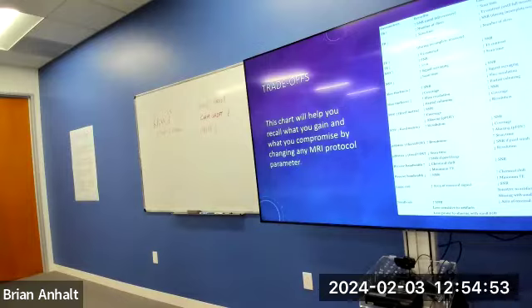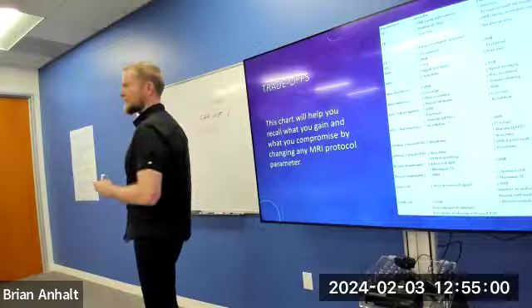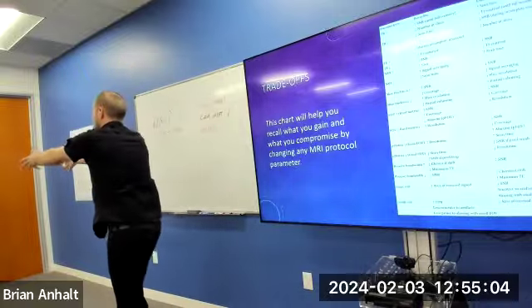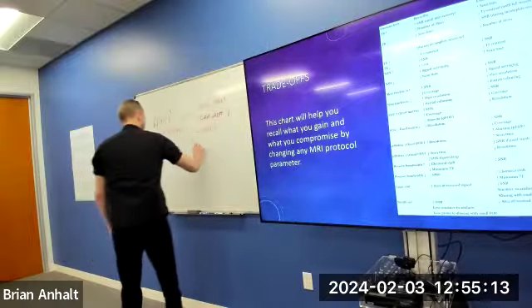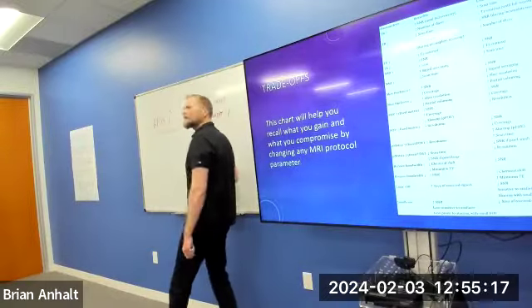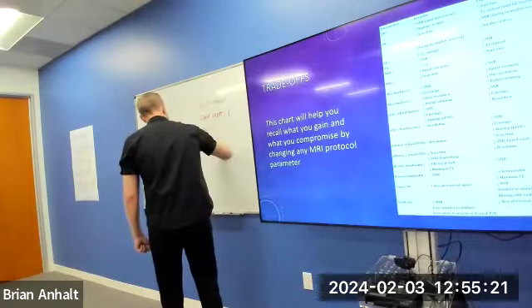What happens physically in the scanner? What's going on in the scanner at this point? We raise the bandwidth, that's just putting a number on the machine, but what's happening physically inside the MRI machine? Something about the gradient. Yeah, we get a steeper gradient, so our frequency encoding gradient gets steeper.